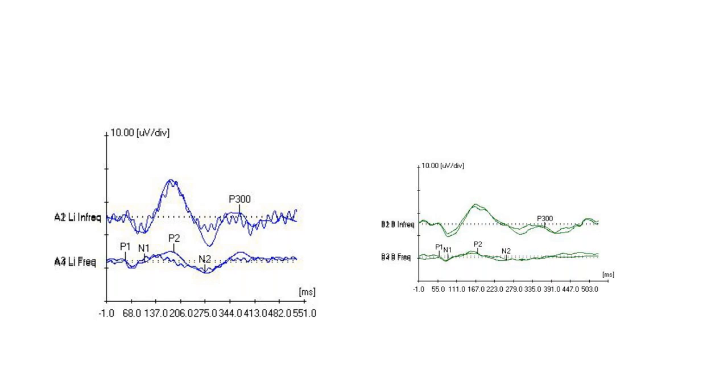Example, Kanso versus N6. I think Kanso is the off-the-ear one, and N6 is. Yeah, Kanso, N6. And the other, I think I need to answer that question. Yeah, there's a follow-up comment, ma'am. It says no, off the ear or BTE processors, it is mainly to do with the transmitter coil. Yeah, that's what I said. Whether it is off the ear or behind the ear, it really doesn't make a difference.